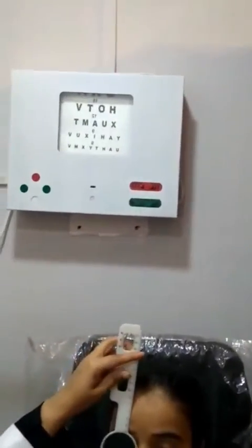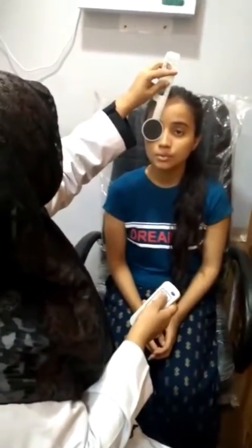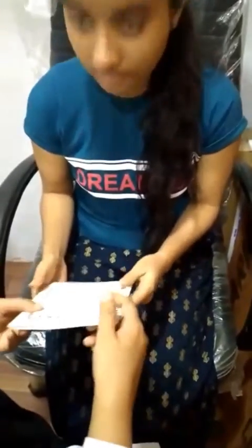X, U, A, H, I, X, U, V. U, X, A, H, O, T, V. X, U, V, A, H, I, X, U, V. A, H, I, X, U, V. That's it. Your vision is good and fine.